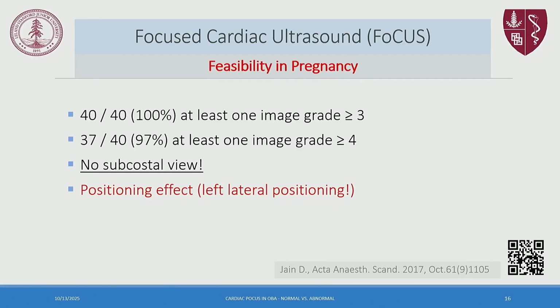They disagreed. They were not able to get a subcostal view. We will see that later. And what they also emphasize is that you put your patient in left lateral decubitus. So that's for the normal pregnant patient, but how is it for C-section?